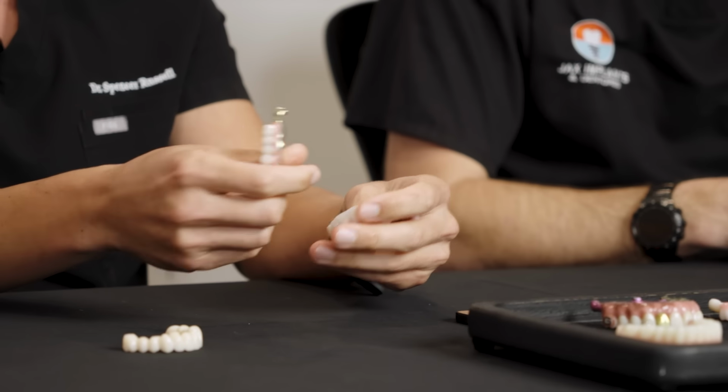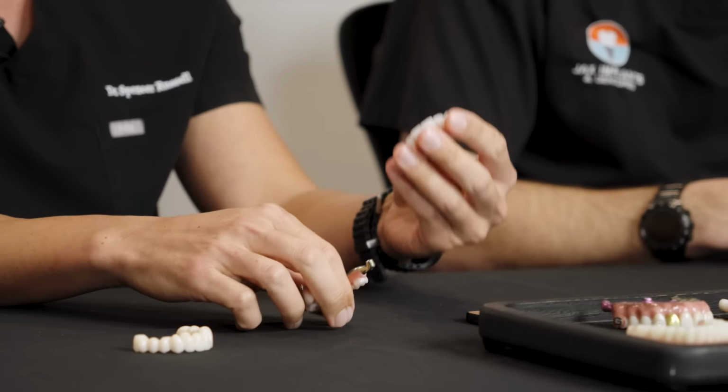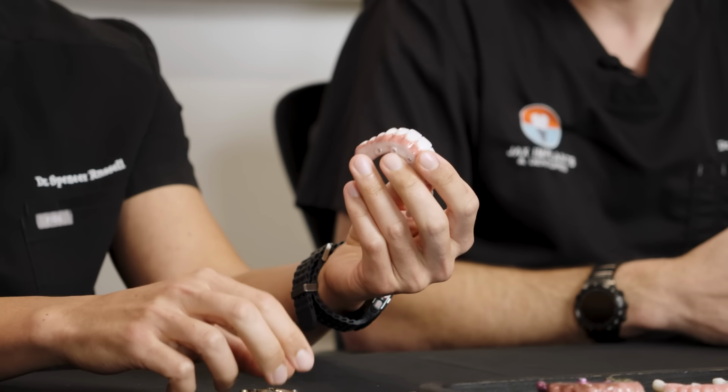And that's not to say there's not a material that'll come out in the future that will replace zirconia, but for the time being, this is still the best we have. So to dive into a little bit now, the zirconia versus having titanium inside it. There are places that'll tell you, oh, having titanium is always going to be better, or only having zirconia is always going to be better. And that's not the case. It's like a lot of different things out there. There are pros and cons to different ways of doing things.